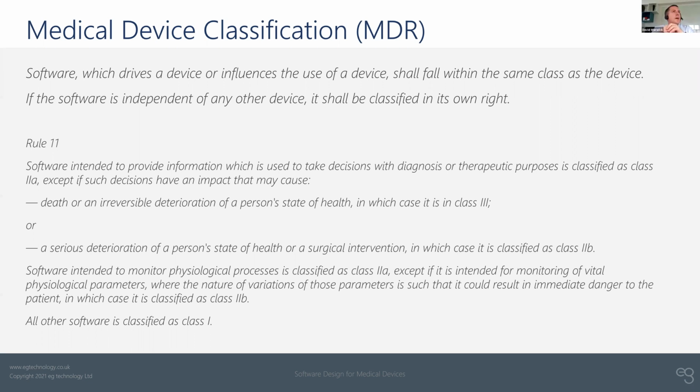Okay. Yeah. So as I talked about earlier, I think I would probably approach that by thinking about the broader context of how the information delivered by your system is going to be used. Obviously I don't know a huge amount of detail about it, but that does sound like it is sort of decision support software rather than an individual data point.